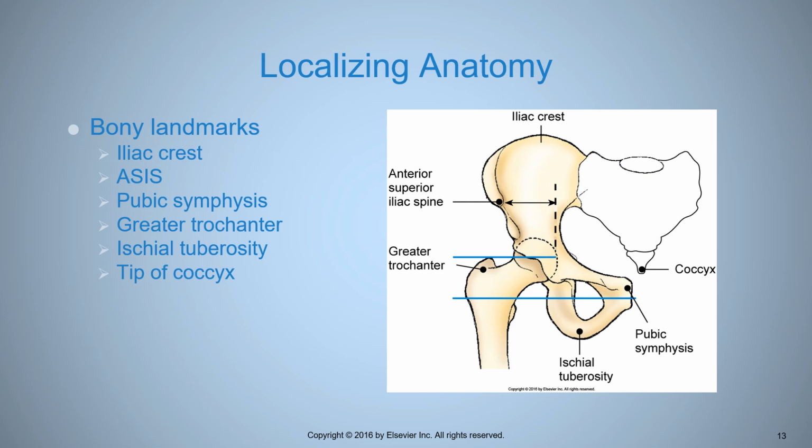All right. So if you center to the plane of the greater trochanter for your hip projection, you're not going to be far off from what the book actually says you should center. Okay, and that's where we're going to get into localization of the hip joint without flexing. Now I know for routine hips, you just flex, look for the crease, aim for the crease, bang, you're centered to the hip. Okay, don't make things harder than they have to be. I totally get that.